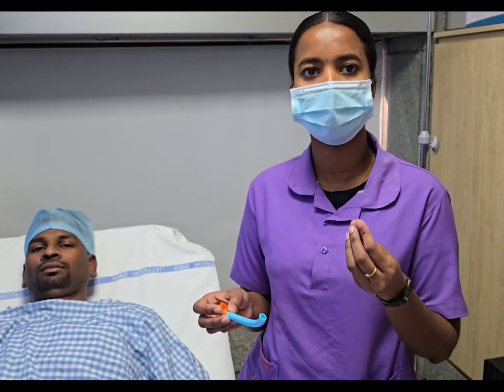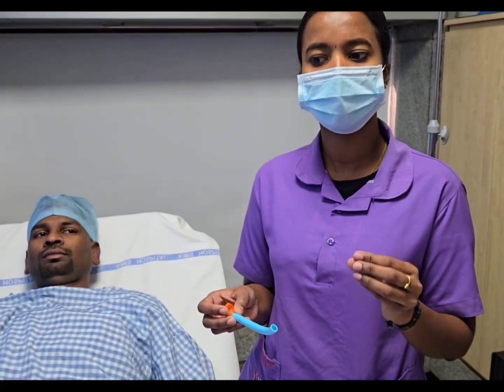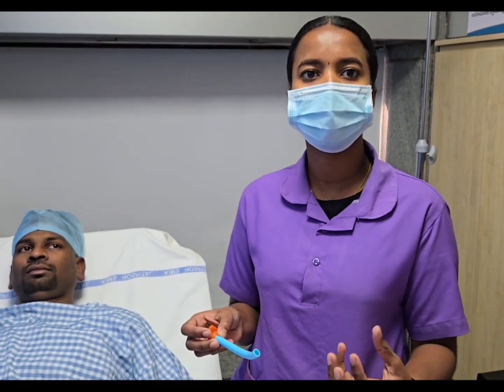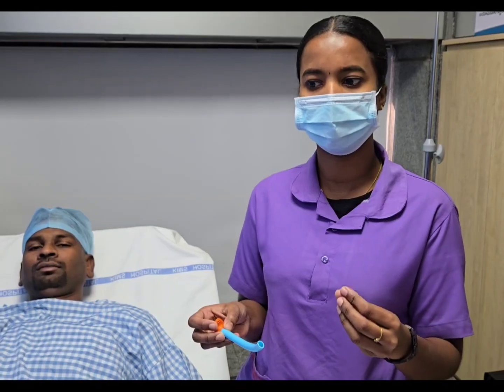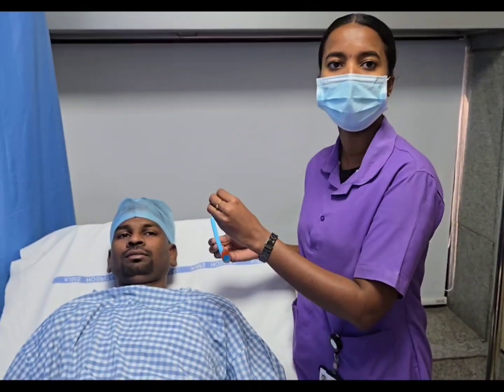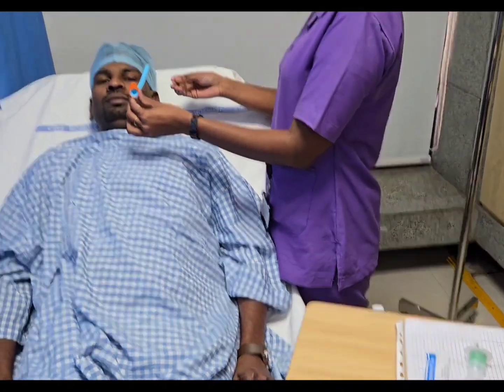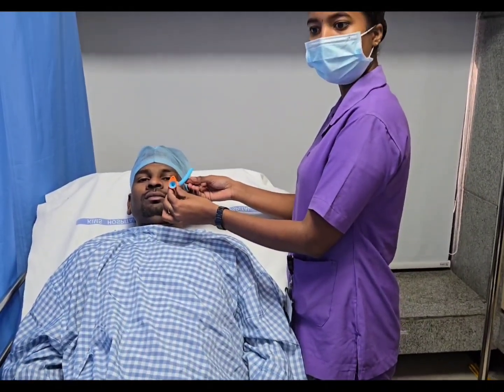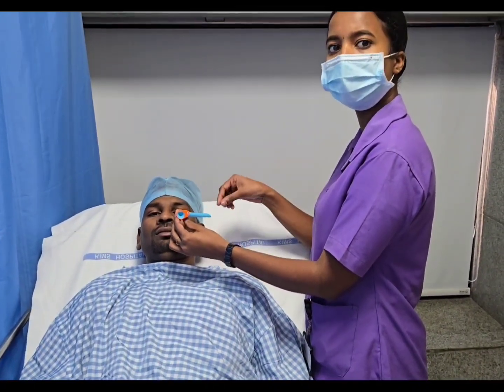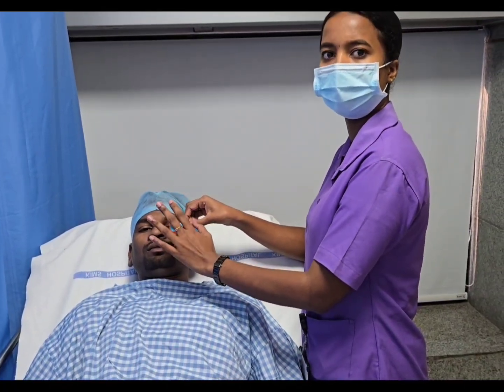Before using it, we also have to lubricate it, because we have to prevent any friction, bleeding or trauma. So first we apply lubrication. After applying lubrication, it is gently inserted into the nasal septum and slightly rotated toward the posterior aspect, to the back. Then it will be secure only here.